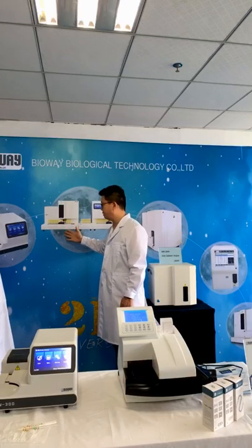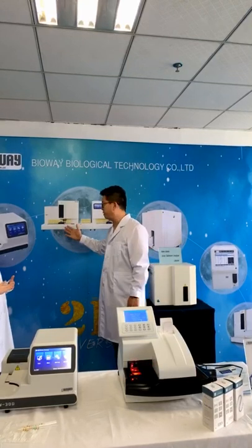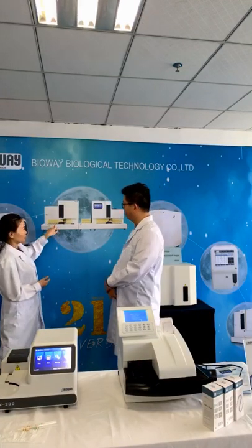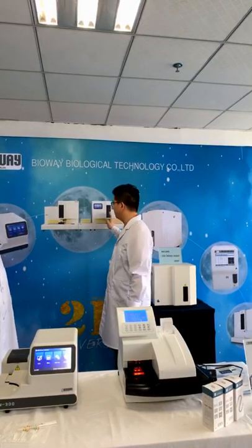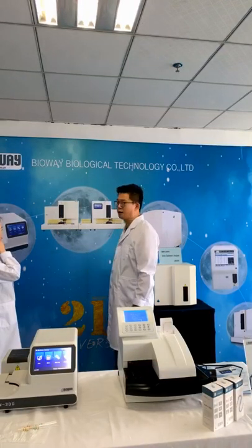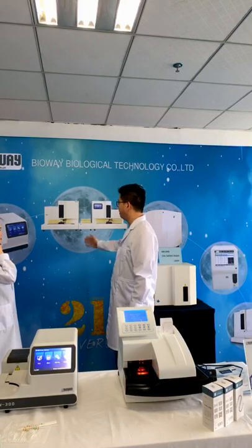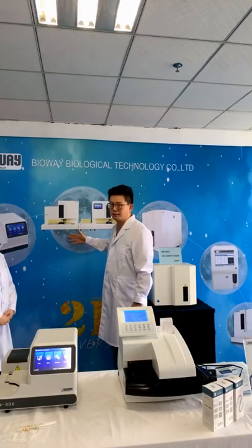Test speed, right? 120. It determines the final test speed, which is 120. Both of the devices have an emergency seat, just like this blue and black seat. So if you have an emergency use, you can just put the tube into this seat, and it will individually perform the test.